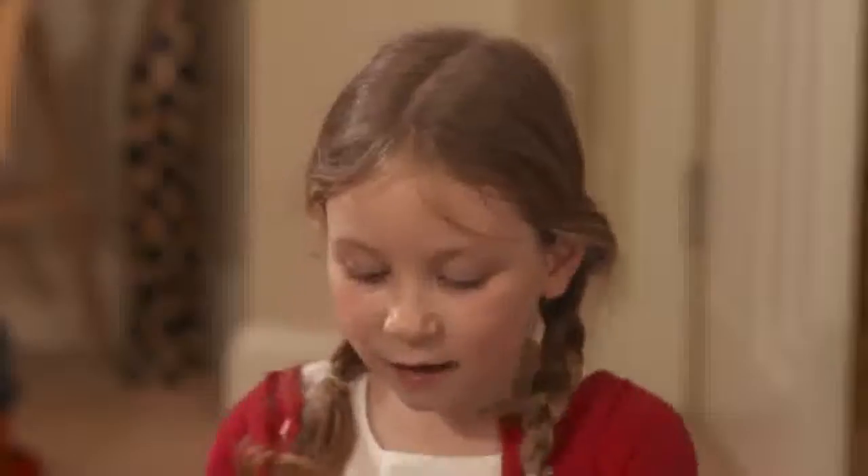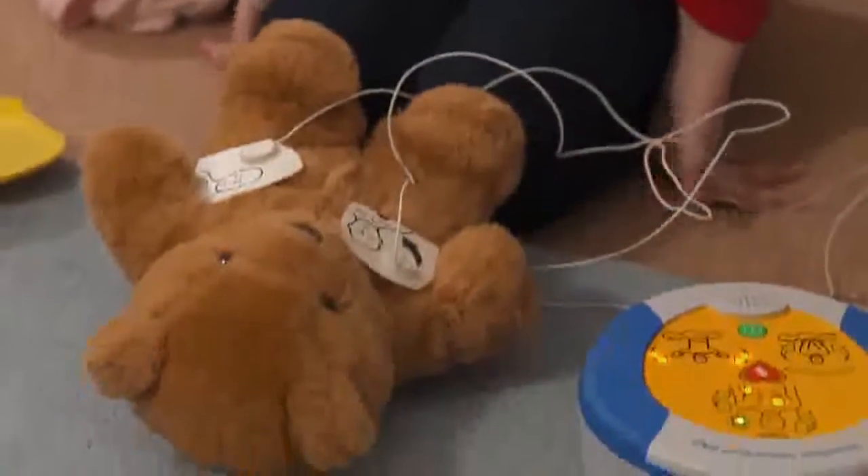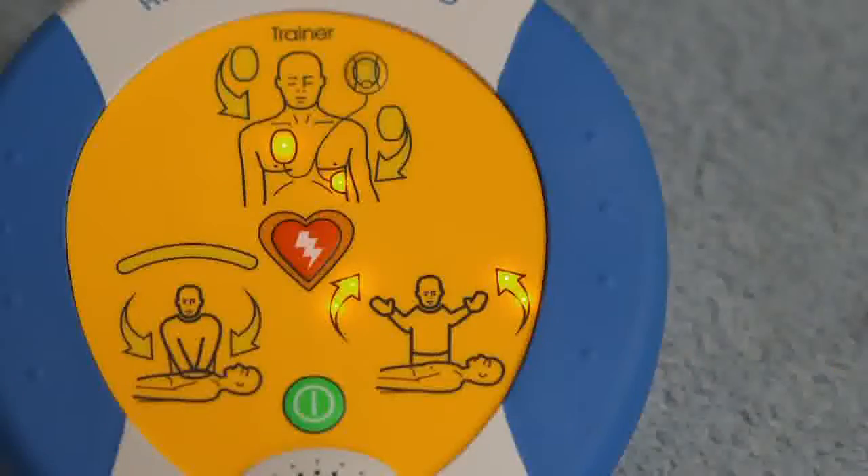Assessing heart rhythm. Do not touch the patient. It won't give Teddy a shock unless he needs it. And now we wait. Assessing heart rhythm. Do not touch the patient.